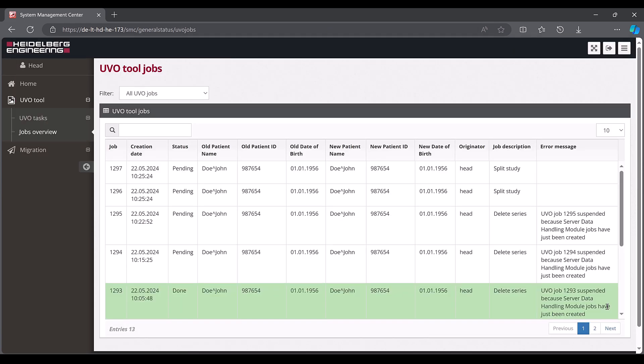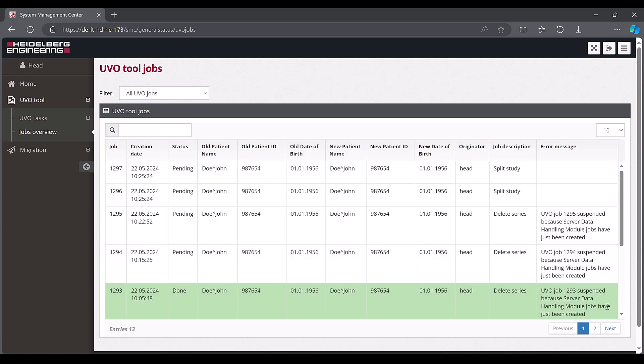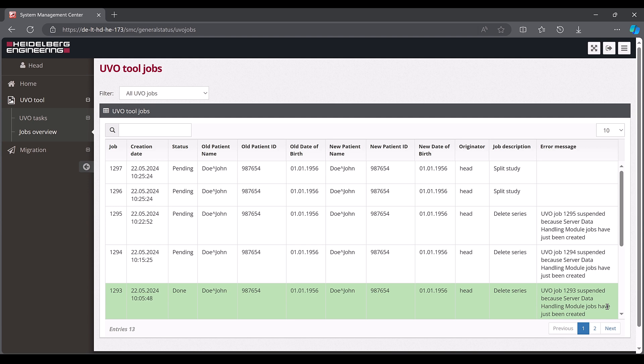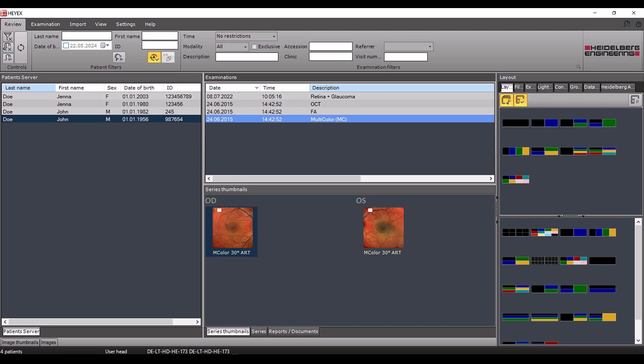You will then be directed to the jobs overview area, where you can see an overview of all jobs. Changes that have been completed are highlighted in green and have the job status done. Pending changes, such as splitting examinations, have the status pending. As soon as the UVO tool has successfully completed a job, the changes are not only visible here, but also in the navigator.